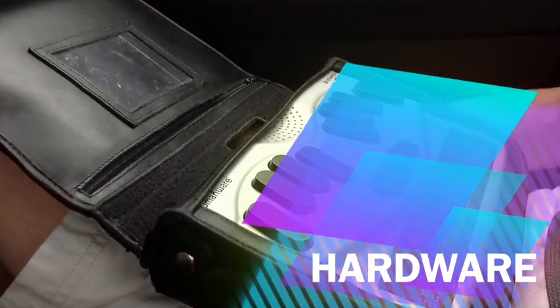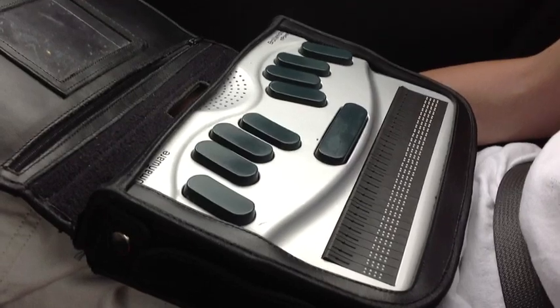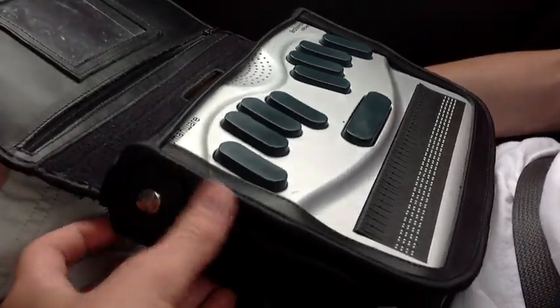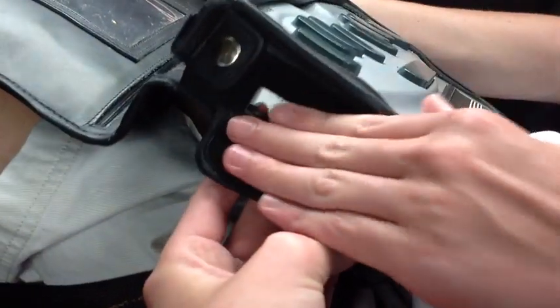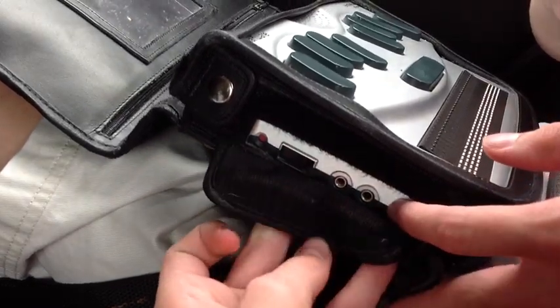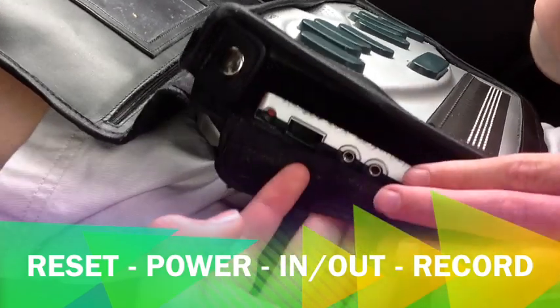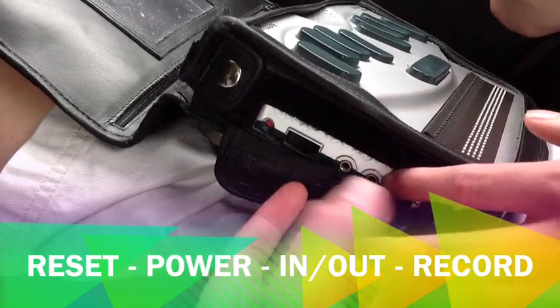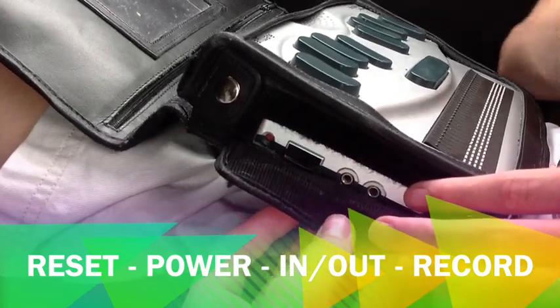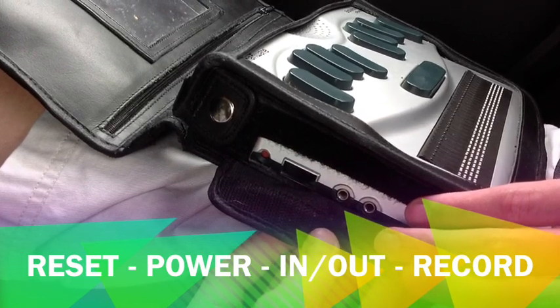So Brandon, let's start with the hardware. For each different model of BrailleNote, there are different hardware configurations depending on the model you have. Let's talk about this current model. Starting on the left side under this velcro flap — down where my finger is — is the record button. It's a vertical-shaped kind of button recessed inside a hole.